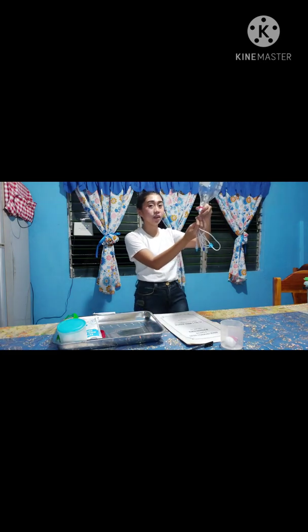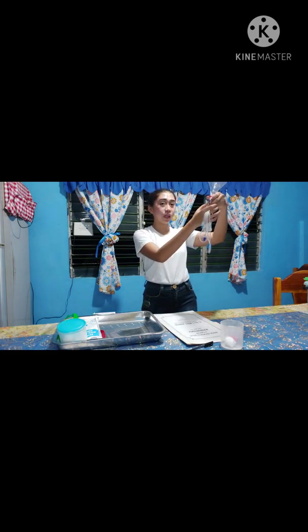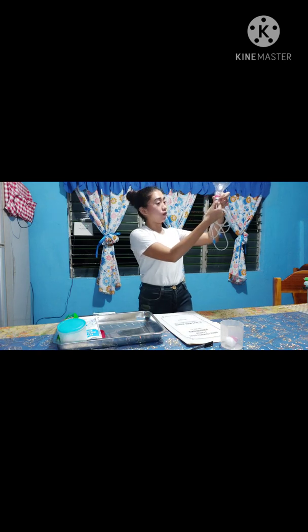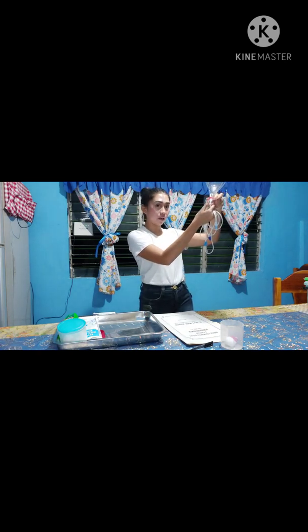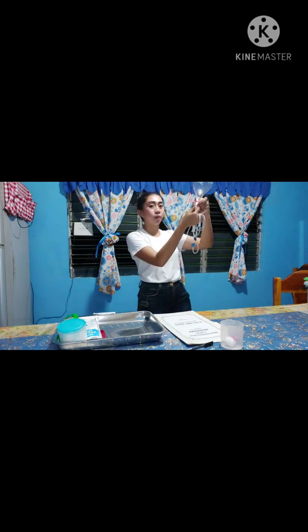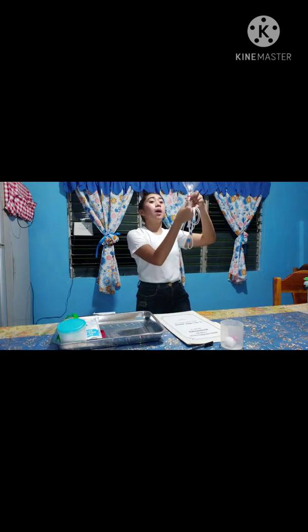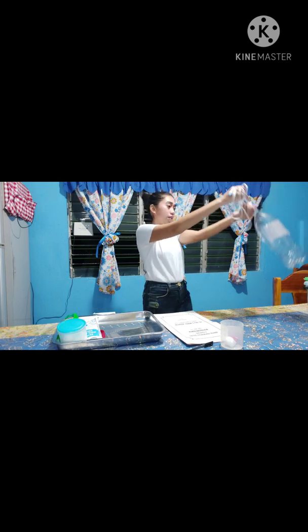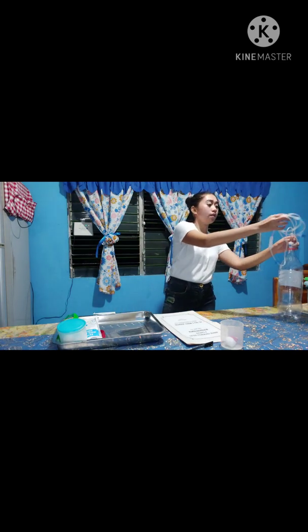And then after that, we're now going to fill in the drip chamber with solution by pressing lightly on it. So we're going to press it lightly, pulling just a little bit. And then after that, hang it to the IV pole, open the tubing, and then fill the tubing completely with solution, purging the air out. So we're going to hang it. Let's assume that it is already hanged.